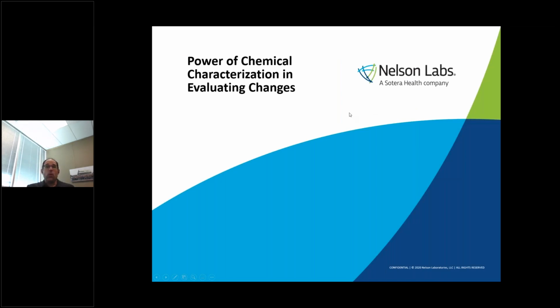Now, the one thing I do want to hit home, and it's something that has started to become much more used, not just to evaluate changes, but also just to look at biocompatibility. The new MDR has really emphasized, and FDA has emphasized, the desire or the benefit of chemical characterization. For me, I love chemistry for biocompatibility.